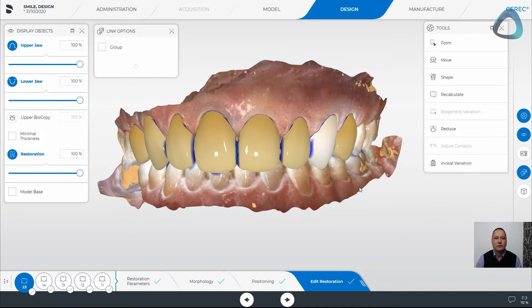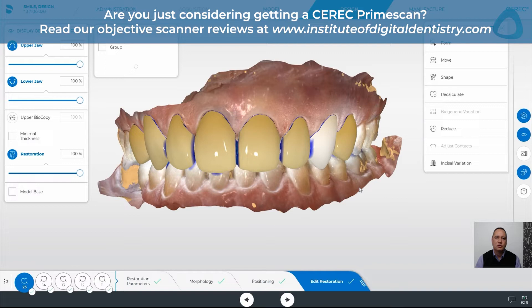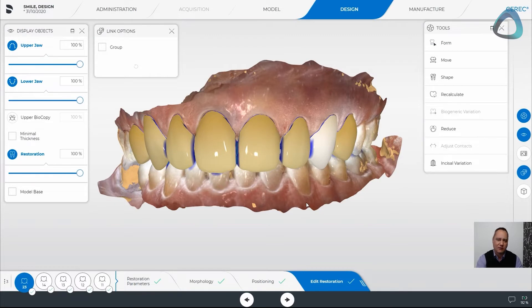What is the smile icon for? It gives us a midline reference, a nose reference, and a canine reference so that we can line things up. It also gives us a reference of where the lips lie in the smile rest position relative to the length and extension of the teeth — basically checkpoints to make sure our planes and angles are right and to give us a visual indicator of what it'll look like behind the patient's mouth.